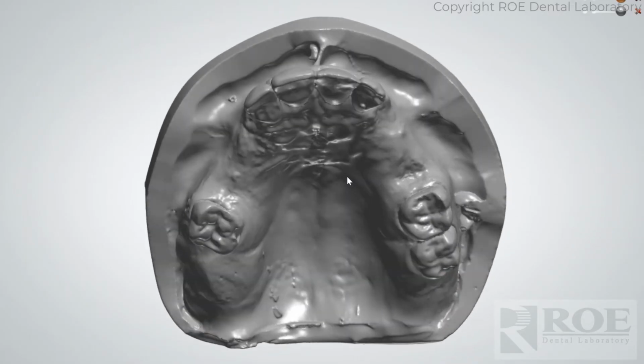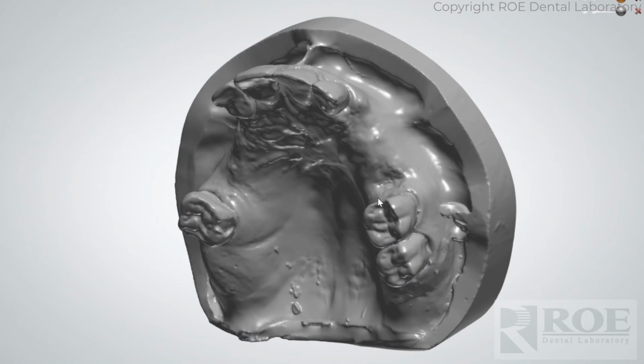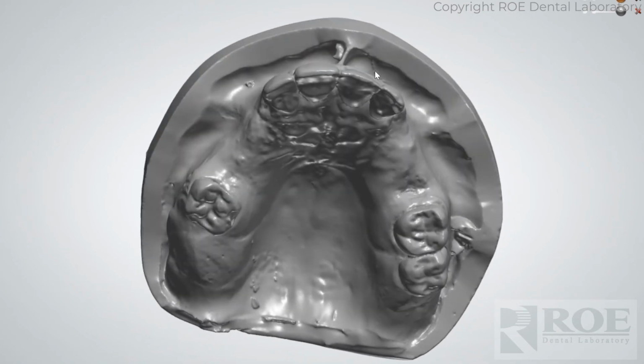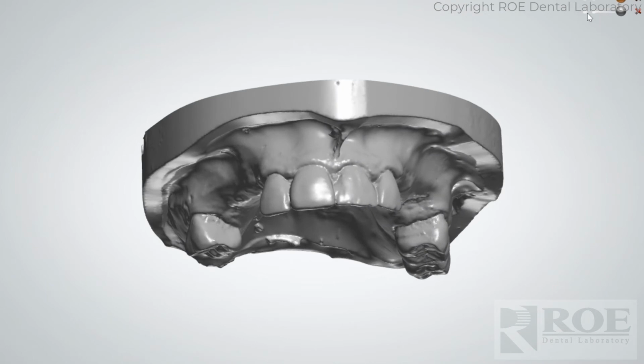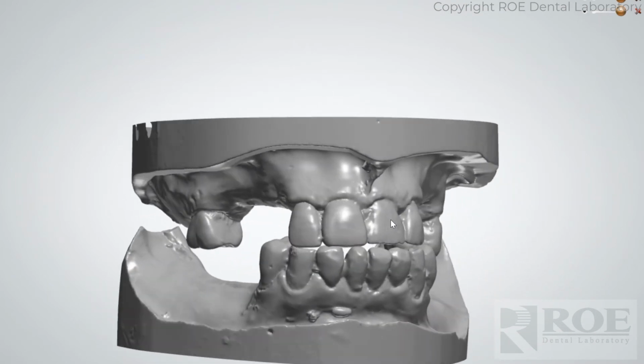And with the maxillary cast, we always want a full palate all the way back to the vibrating line. You want to capture the full vestibules. This is very important for how the initial pin guide fits in, especially the vestibules. And if you want a backup denture, we need the full palate. And then same with the opposing, all the land areas.